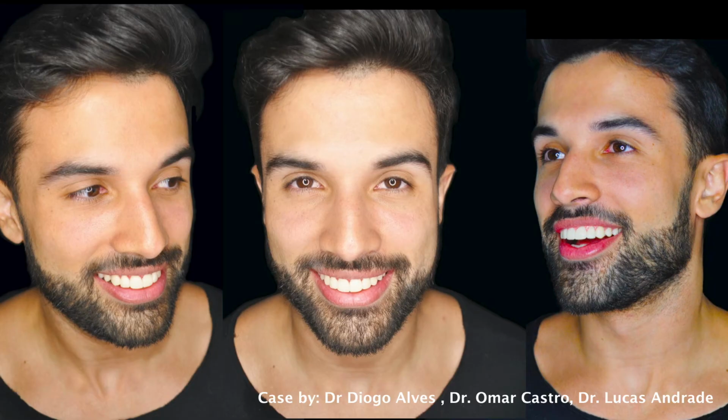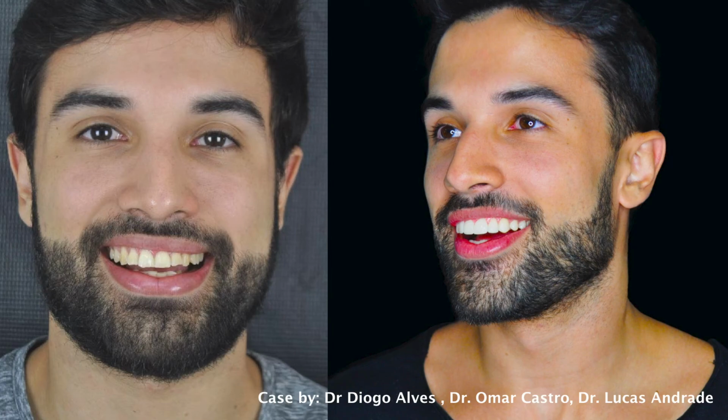So the patient was very satisfied with the final result, as it was very affordable for him. He knew exactly how his smile would look since his first visit. This method of conducting a minimally invasive flowable composite veneer treatment is very cost effective, and it's a great solution that you can implement efficiently into your practice.